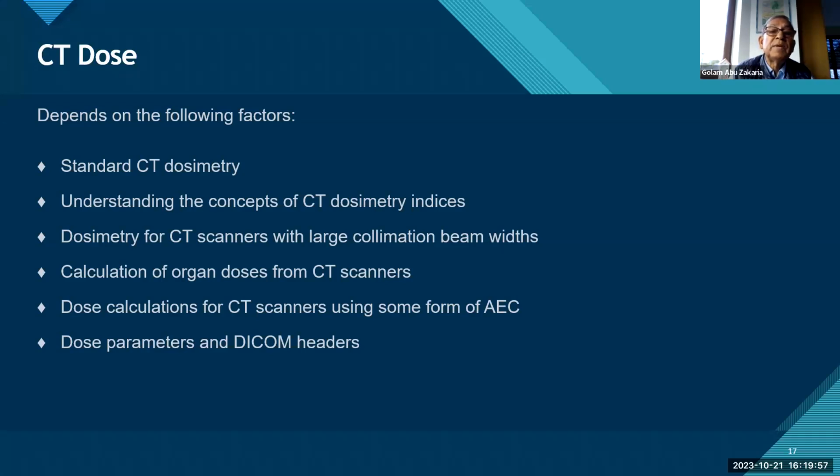This effective dose is actually the dose that should be determined, and there are many tables, and Kathrin has shown you how it is calculated. From the tables you can calculate it for the different bodies, and there are some factors, and these factors also depend upon different parameters. Of course, you can also download some programs from the internet, and you, the physicist, should check such programs before applying them. You can calculate from the CTDI the DLP, and then of course the effective doses.